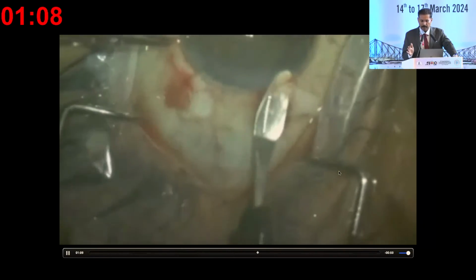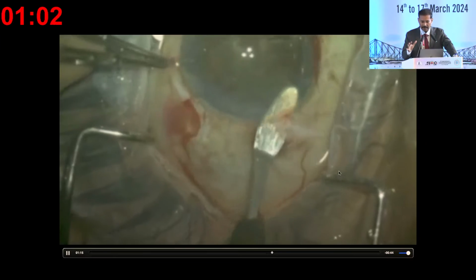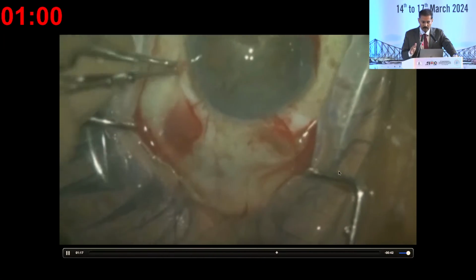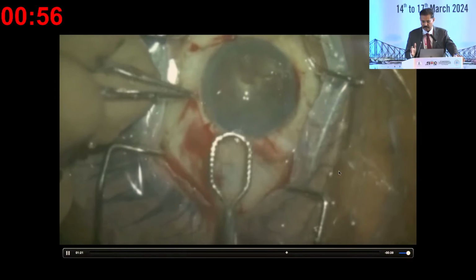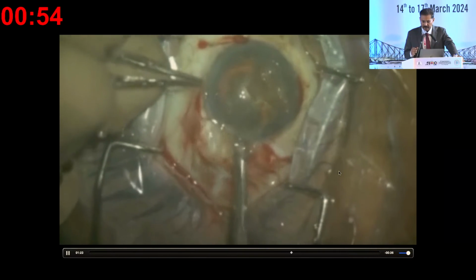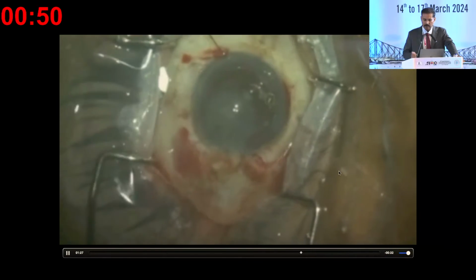So there is no compromise on the size of the tunnel here, because the nucleus is very large and you need to take it out cleanly without manipulating in the anterior chamber more. At least a 7 to 8 millimeter internal opening is required to get this very hard cataract out, and without irrigating much it is delivered out, and now luckily it comes out in one piece.